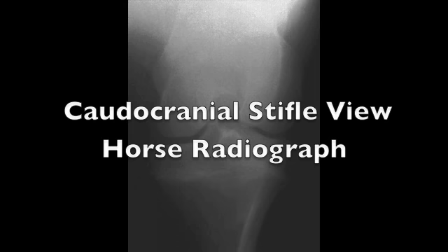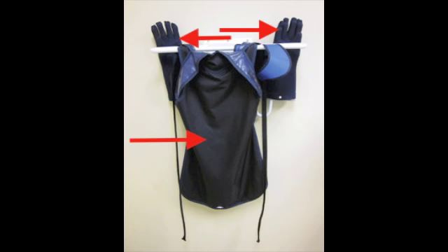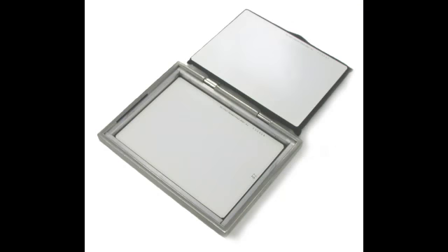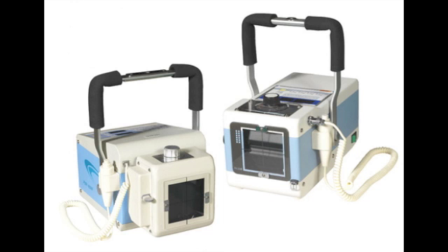The equipment you will need is proper personal protective equipment such as a lead gown, lead gloves, and thyroid shield. You will also need a dosimeter badge, a cassette with film, a cassette holder if possible, and a portable x-ray machine.